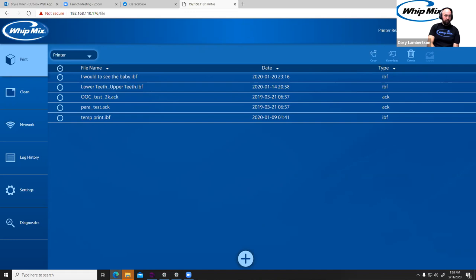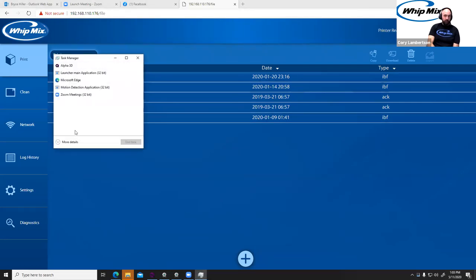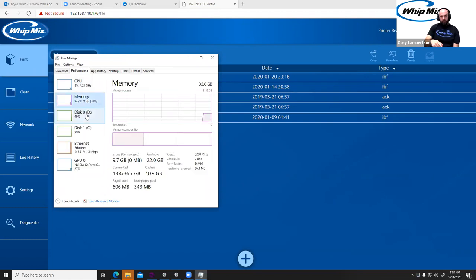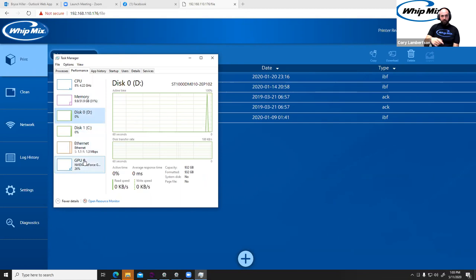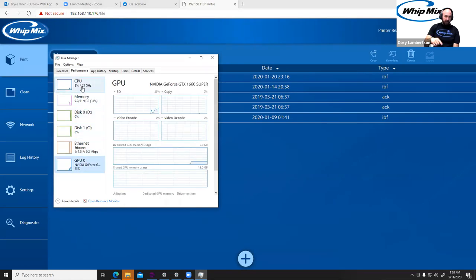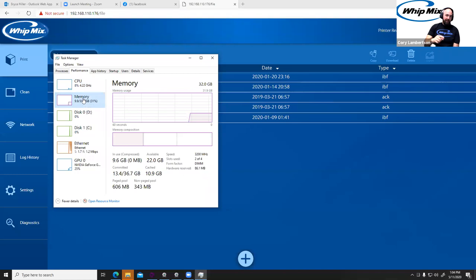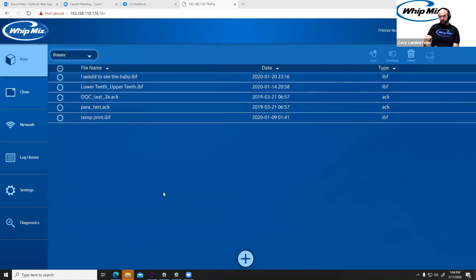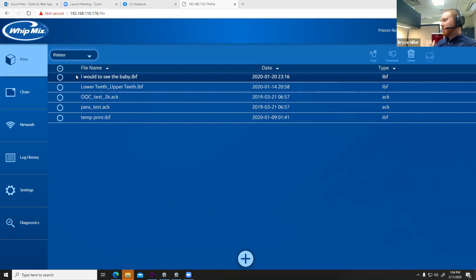The specifications of this computer and what is needed for the software are completely different. To actually run the software, it's recommended that you have at least an i7 processor or AMD Phenom, NVIDIA GeForce 830 or AMD Radeon R7 M340, 8 gigs of RAM, 2 gigs of disk space, and Windows 7 or greater as the operating system. That's just the recommended specs. This computer is a lot stronger than what you have there, what you might call overkill.